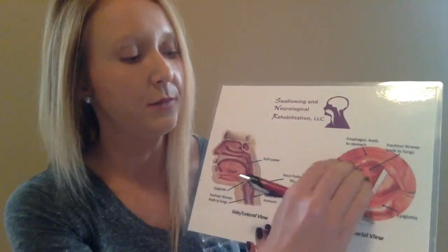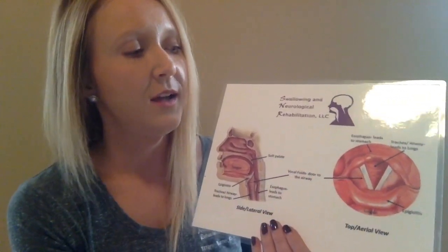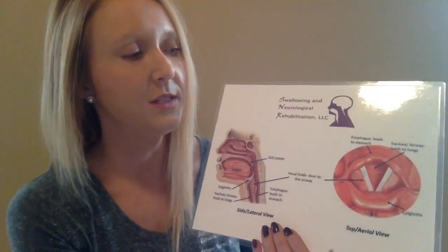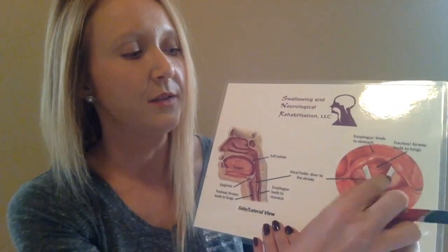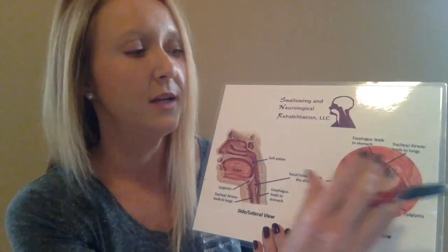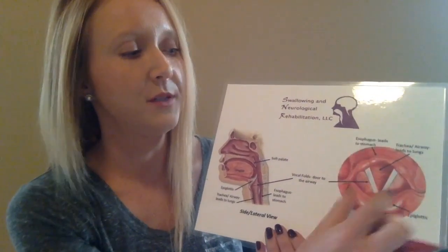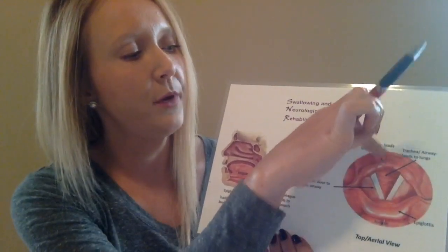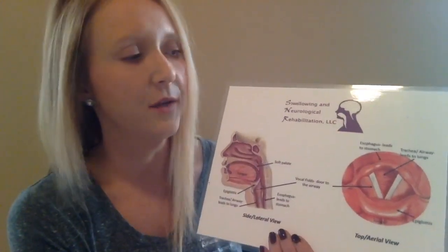On our view here, when the scope is in place, this is what we see on our screen as the patient takes a bite or a drink — we see that come back to the back of the tongue. In a normal swallow, the vocal cords and the tissue called the false vocal cords close really tightly. That epiglottis flaps over to cover the airway, and then all of those muscles squeeze and pull open the sphincter at the back to let the food and liquid into the esophagus.